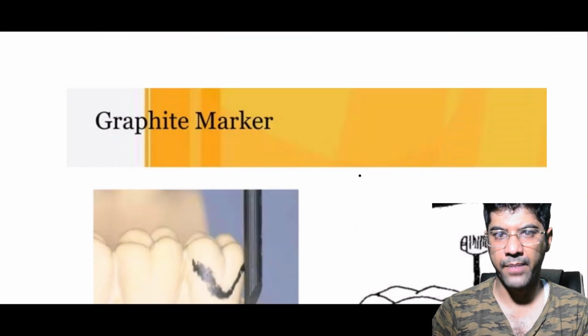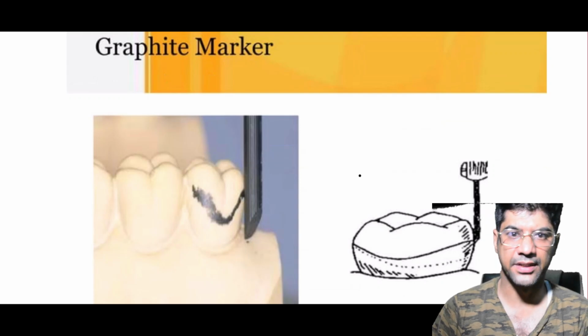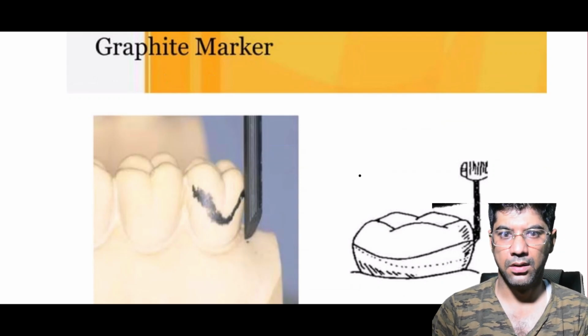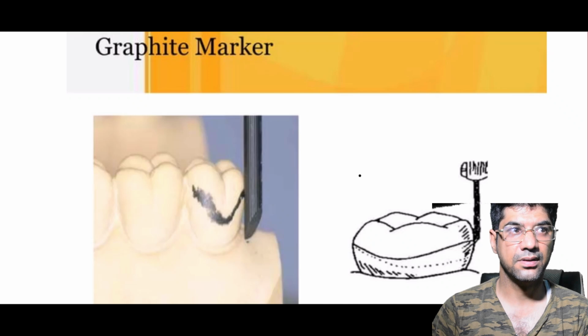These markers resemble the lead point of micro tip pencils and come in circular or triangular cross sections. They are used to draw the height of contour on the cast. After positioning with the analyzing rod, the carbon marker traces the convex area to create the survey line.